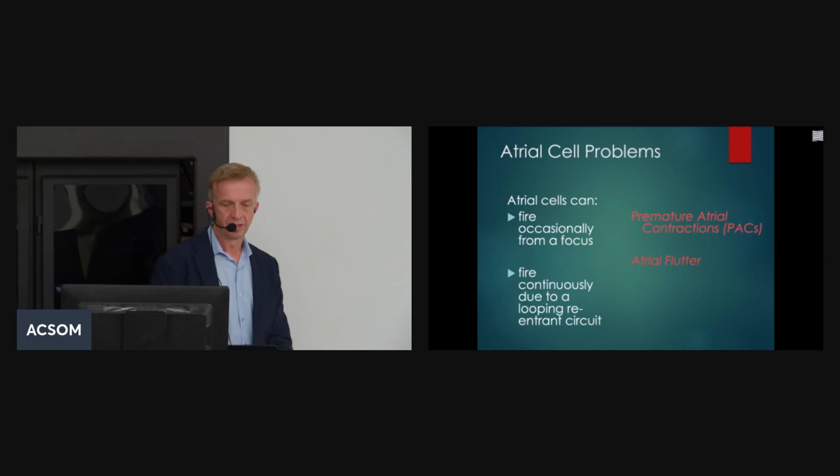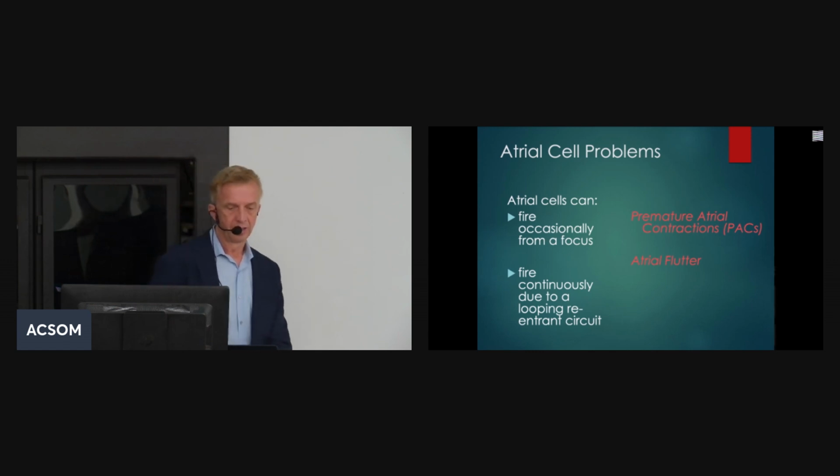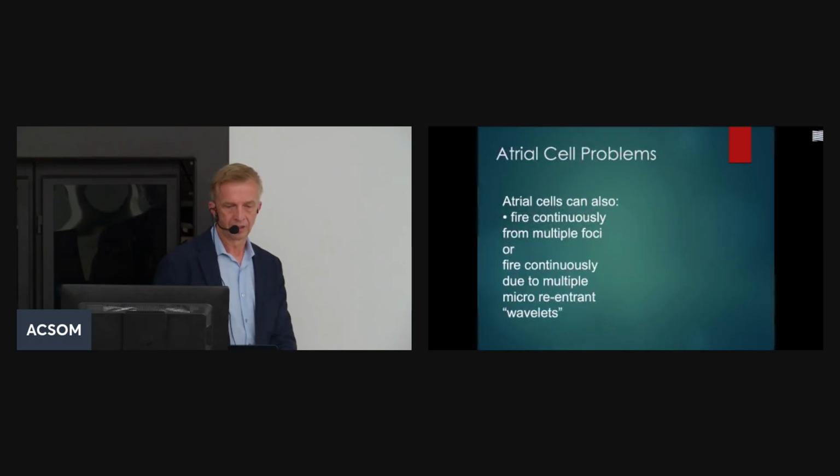There is another arrhythmia which is called atrial flutter, which is also an atrial rhythm, which is regular, and it is caused by the re-entry phenomenon in the atria. And then we'll talk about atrial fibrillation. This is the most common disorganized electrical activity in the atria, causing irregular heart rhythm. We don't need to go through the re-entry.